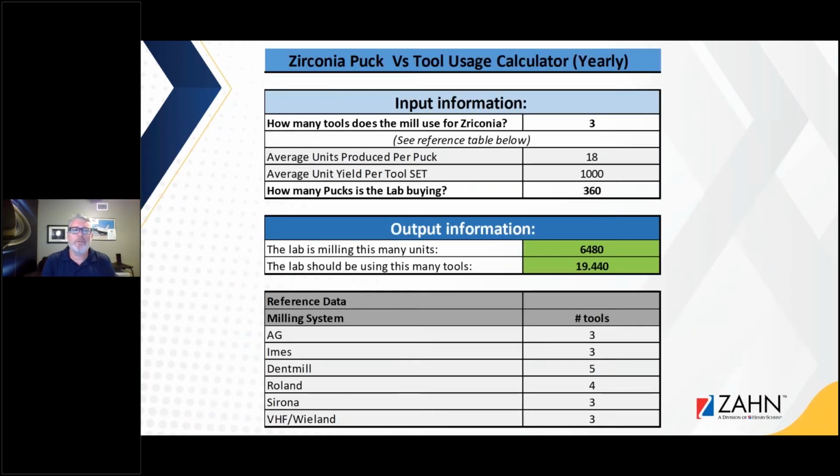We're going to move into another little thing. This is more on the math side here. Zirconia versus tool usage cost calculator. So I've had this question many years, even before I started working here, about how many tools go in each machine. So we broke it down for the most popular machines that we have here in the US currently.